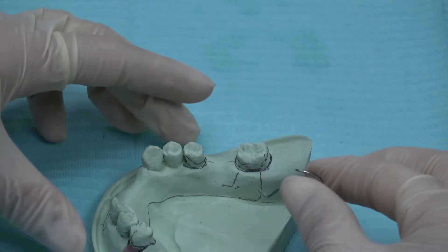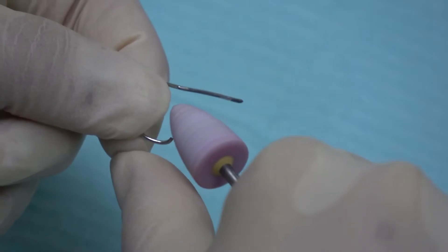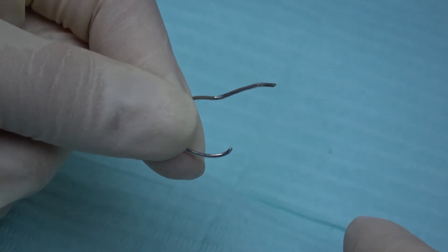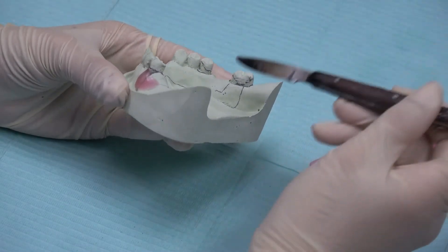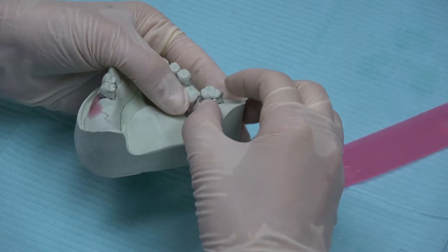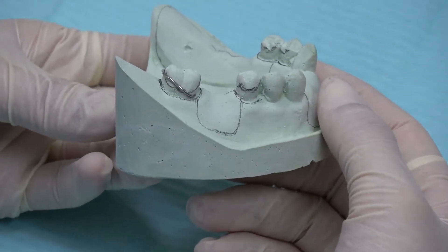And now this is a completed ring clasp. The tips of the clasp are rounded using a stone bur. Use your finger to check that the tips of the clasp are rounded and there are no sharp edges. Seal the tag of the ring clasp with modeling wax, a very thin layer of modeling wax.